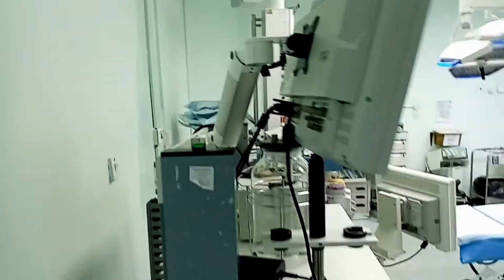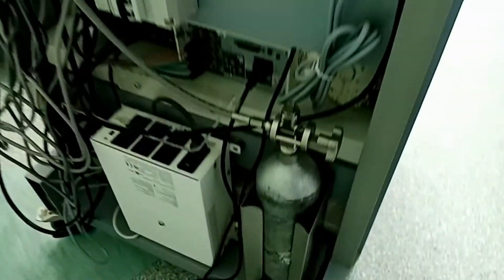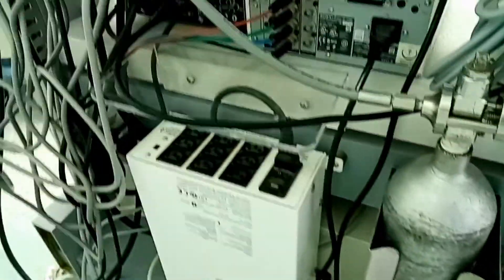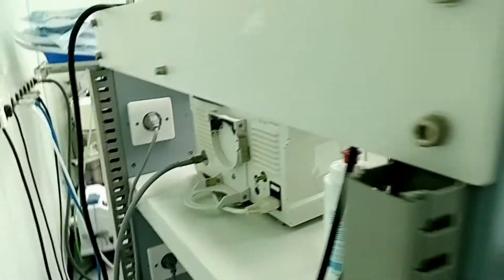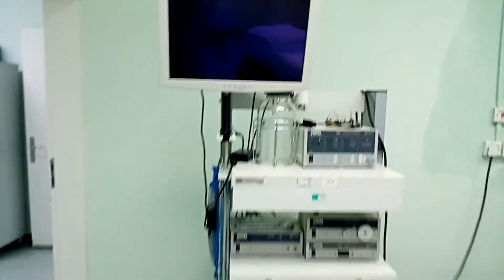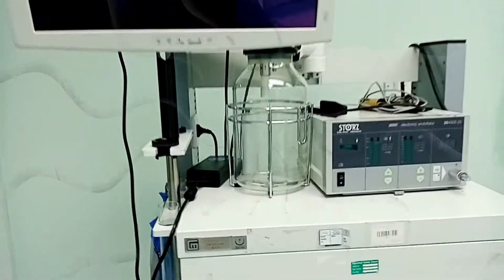ده منظار بطني خاص باستئصال المرارة. هنتكلم عنه بالتفصيل إن شاء الله، بس حبينا نديكم فكرة عنه. من الخلف هو عبارة عن مجموعة من الأجهزة بتضم شفاط، وجهاز ضخ ثاني أكسيد الكربون للنفخ، والجزء الخاص بالكاميرا، مع مجموعة من الآلات. الهدف منه استئصال المرارة حسب التوجيه الطبي. مجموعة الأجهزة دي مع الشاشة بتعرض عملية استئصال المرارة.